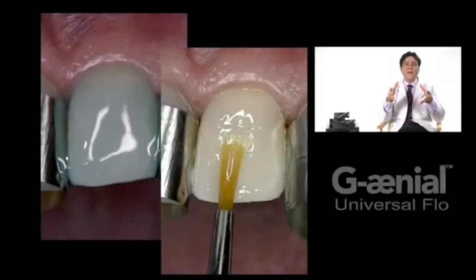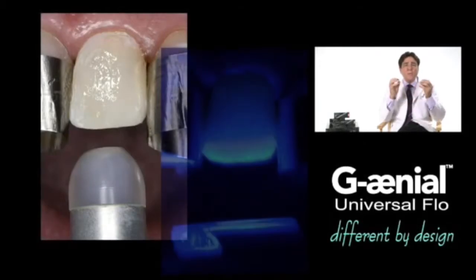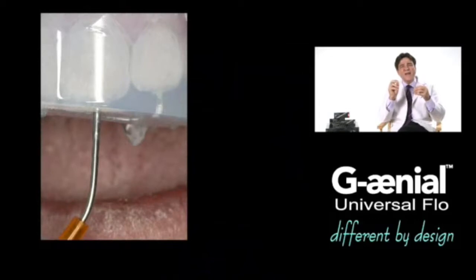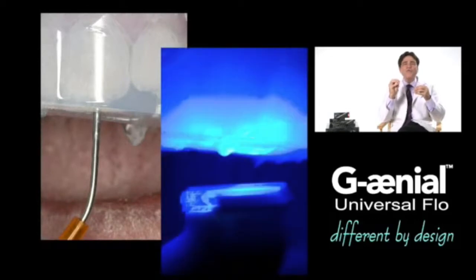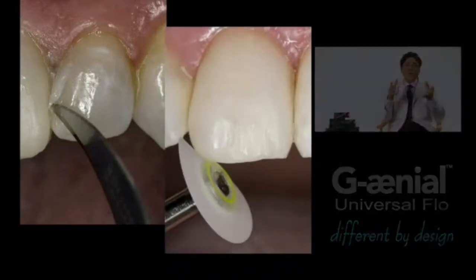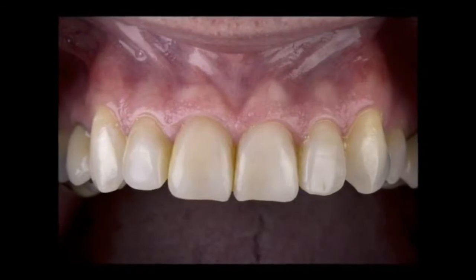This process can be performed intraorally, without anesthesia, and can provide valuable information for proper lip position and phonetic considerations. A clear vinyl polysiloxane impression can be used to replicate the diagnostic wax-up. The matrix can be placed intraorally and used as a transfer vehicle for the flowable composite to be injected.